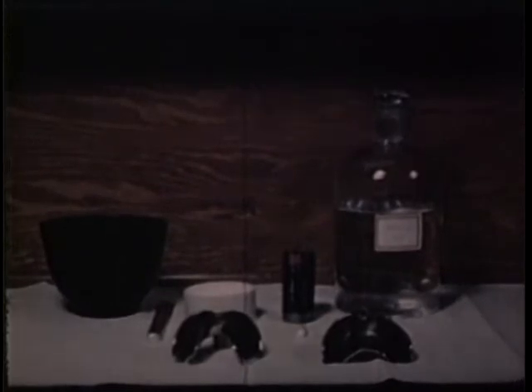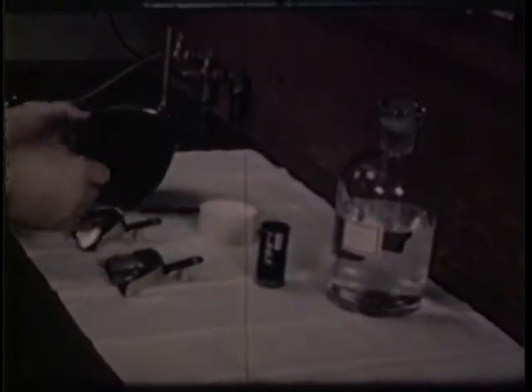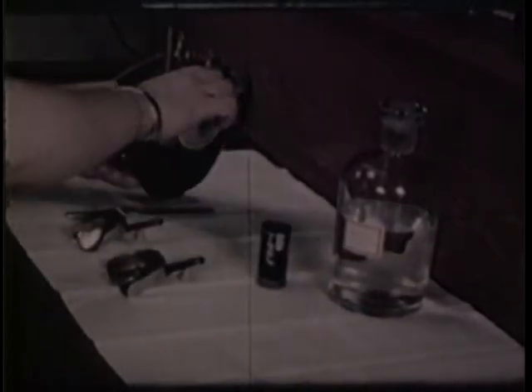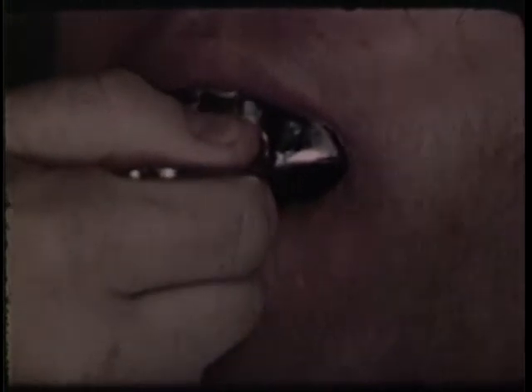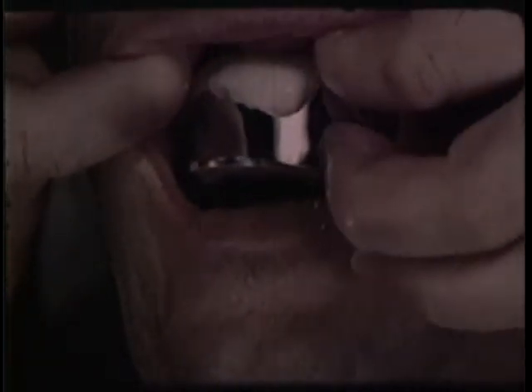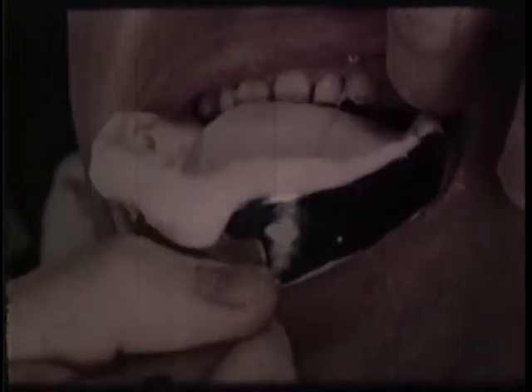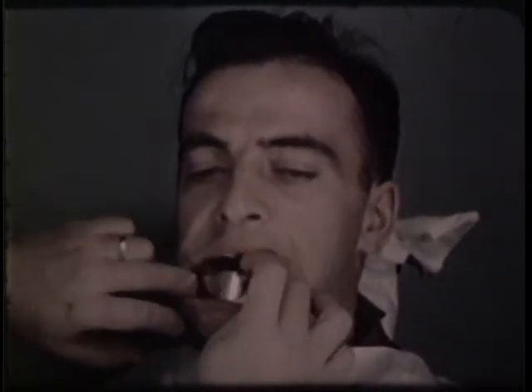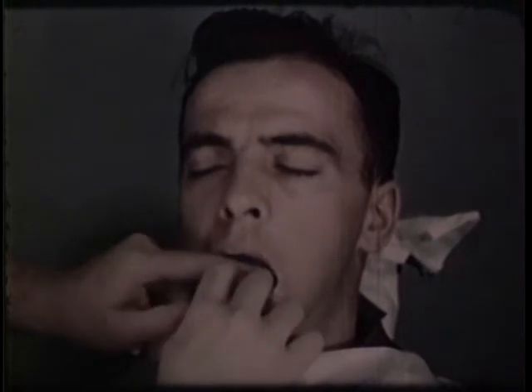The first step in the construction of the screw-lock splint is to take an impression for a cast. Accurate impressions of the contour of the teeth are obtained with ordinary alginate compound — a plastic material prepared in the usual manner. First, an impression is made of the upper teeth. Then a similar impression is made of the lower teeth. Though the lower jaw alone is affected by the injury, both casts are important, for one of the objectives of the procedure is to restore occlusion.